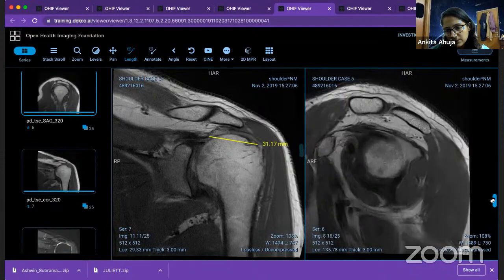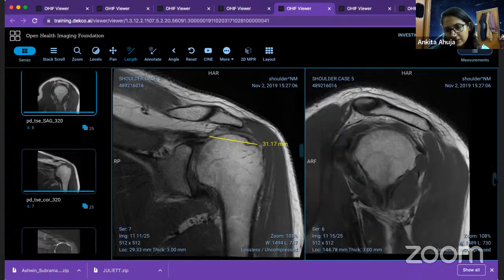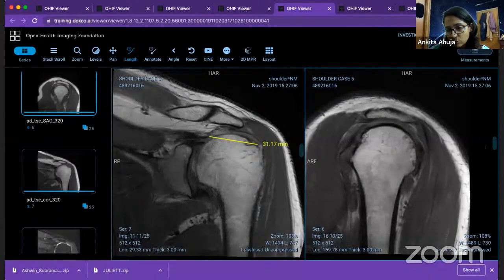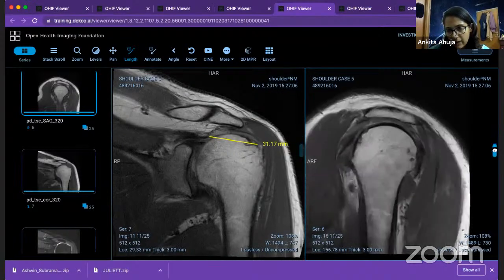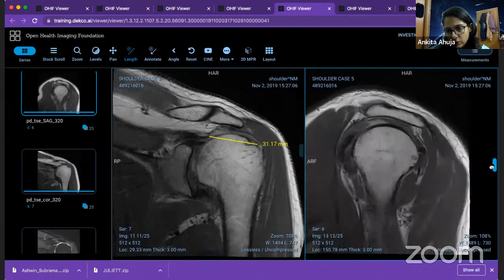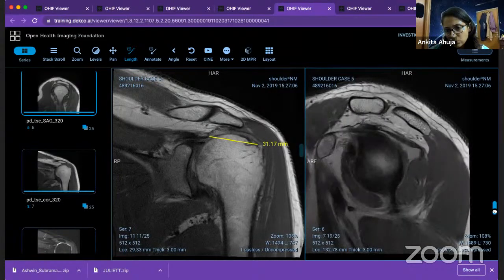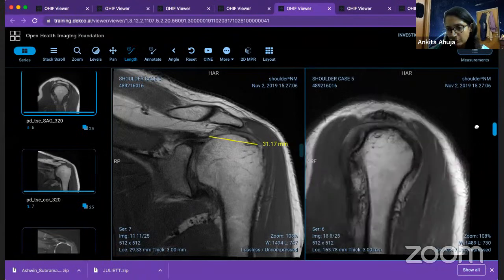As I'm going forward, I do not see this bit of infraspinatus coming really well further. I do not see any tissue over here. This is really small bit of infraspinatus which is coming forward and attaching. So a major part of infraspinatus is also gone, right? So we'll show you this again. So this is remaining residual infraspinatus tendon. The tendon bit which should have been over here is not seen. So see this image again. I'm going back once again for you guys. So going back, you do not see any tendon. You do not see any tendon still. And here, almost a little bit of tendon starts to come. So this is your tear of the entire supraspinatus and a major part of infraspinatus.